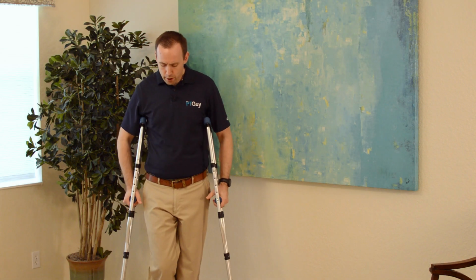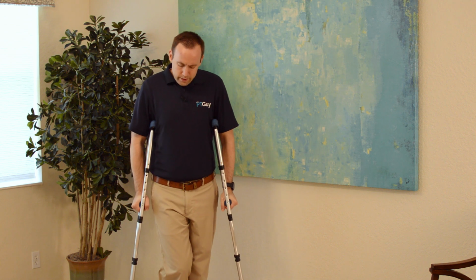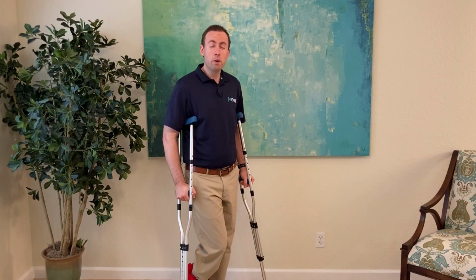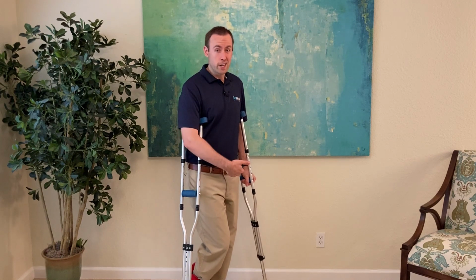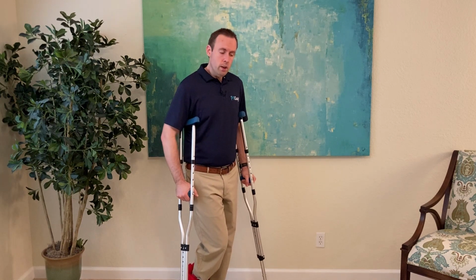You're going to have your crutches at your side when you're standing up. Now, this is an important aspect that you need to know about too. You're going to get pretty fatigued when you're not allowed to put any weight through that one leg because you're standing on one leg. That leg's going to get tired. Your arms are going to get tired.